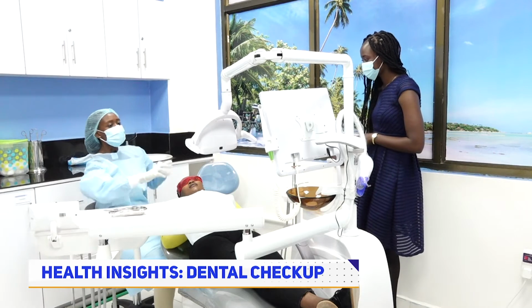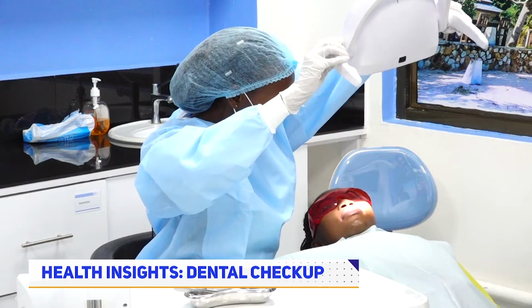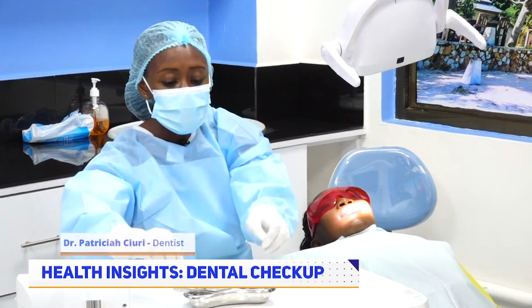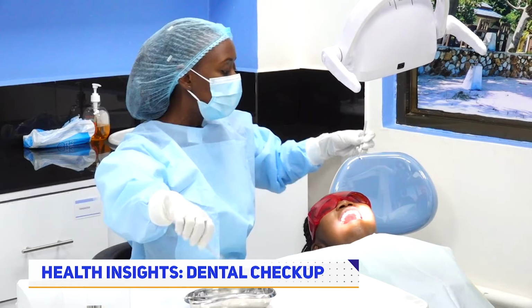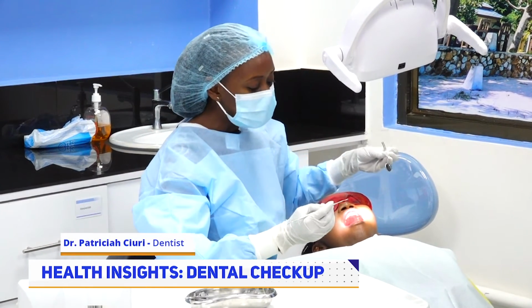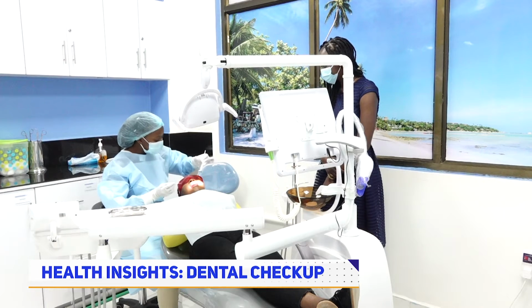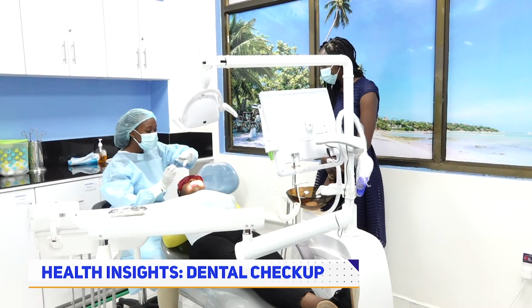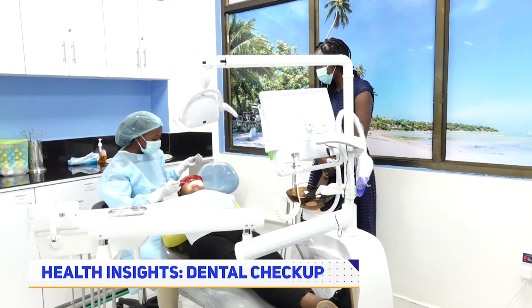Okay, so what we do, we have our light here, which we shine into the mouth, and then we ask the patient to open wide. Here we have a mirror and a probe. These are baseline tools that we use for diagnosis. The mirror helps us to see the teeth, and the probe has one sharp end, sometimes two sharp ends, to help us see if there are any cavities or decay in the teeth.